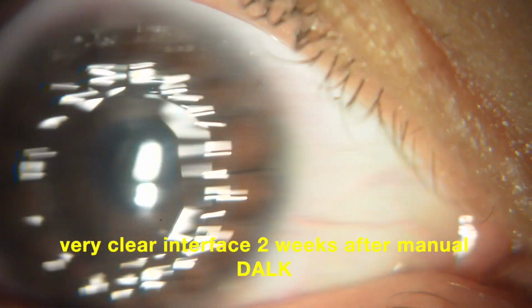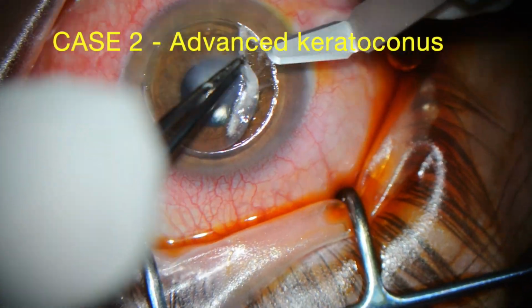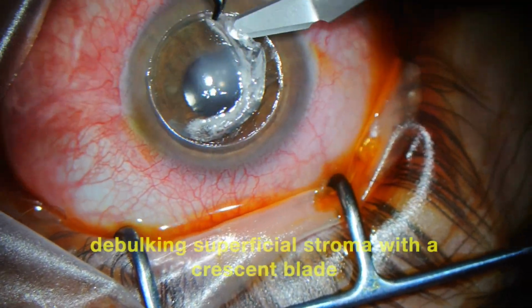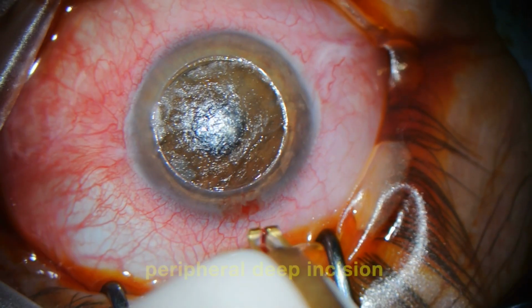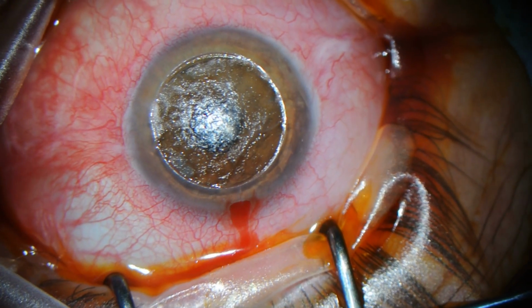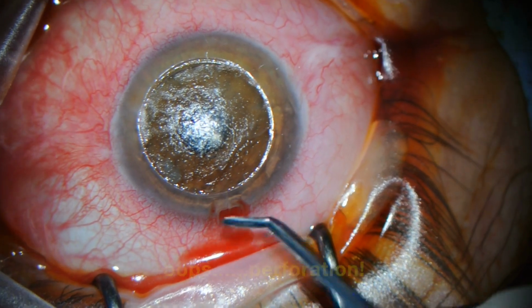Very clear interface 2 weeks after manual DALK. Case 2. Advanced keratoconus. Debulking superficial stroma with a crescent blade. Peripheral deep incision. Oops, perforation.